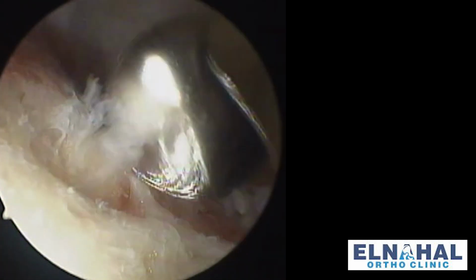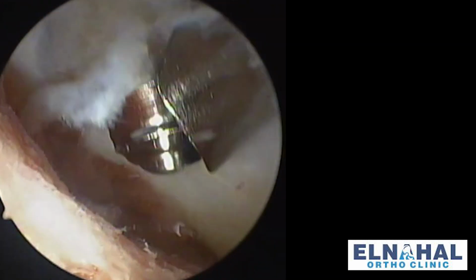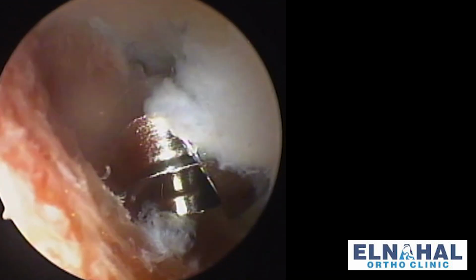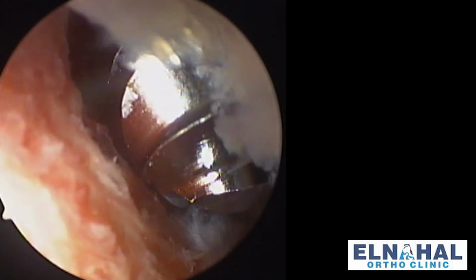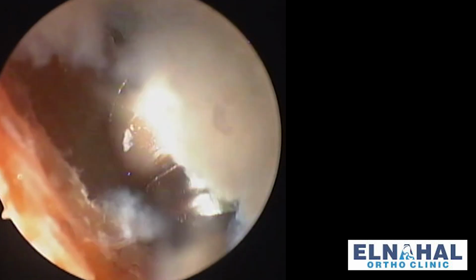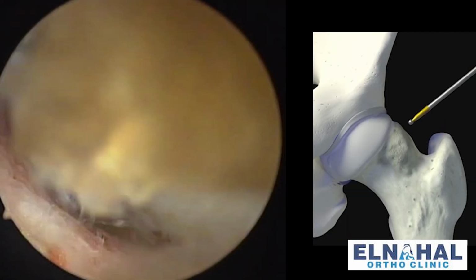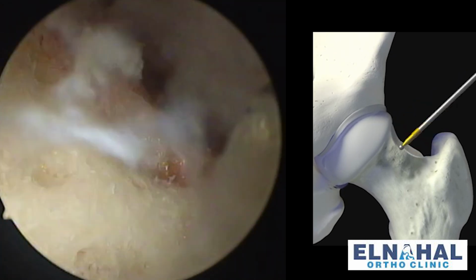This here is the impingement cyst that we saw on the MRI scan. The head of the burr, which is the instrument that we're seeing right in front of us, is around 5 millimeters. So you can see that this synovial pit, or this impingement cyst, is around 4 millimeters or so in depth.